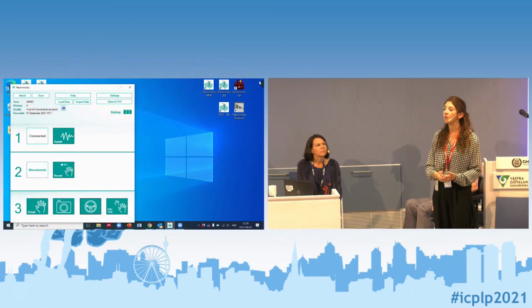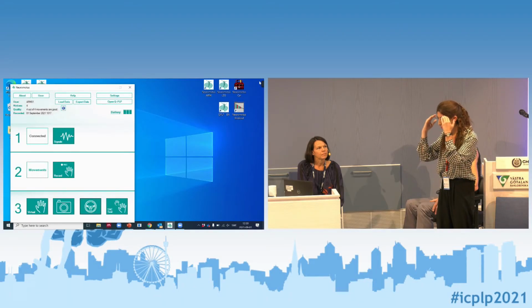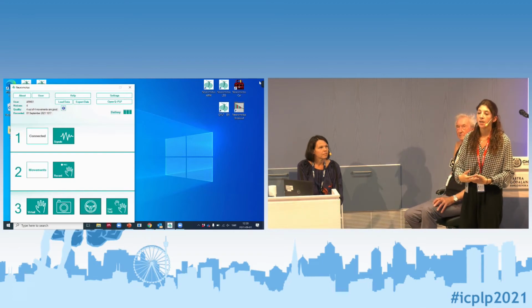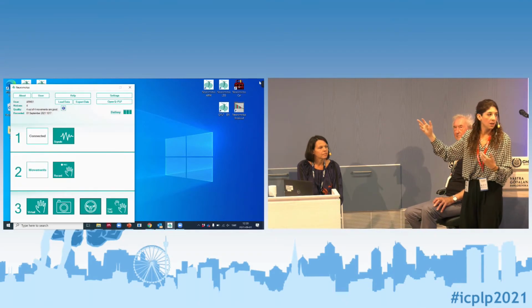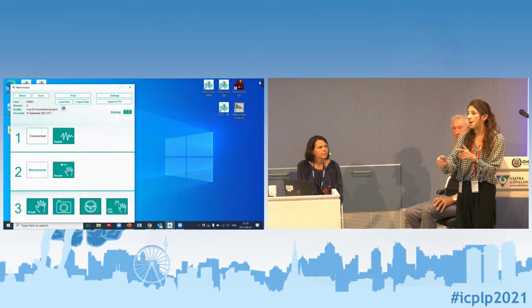The idea is, in a session, you can do all these steps with different movements. So, as I explained before, we have like 2 hours of treatment normally. So you can start with a pair of movements, then we many times do a break because it's quite exhausting for the patient to be able to perform the different movements. And then we continue and do something harder. So again, we aim to promote phantom motor execution while being challenged and doing mindful repetition with all the different stages.